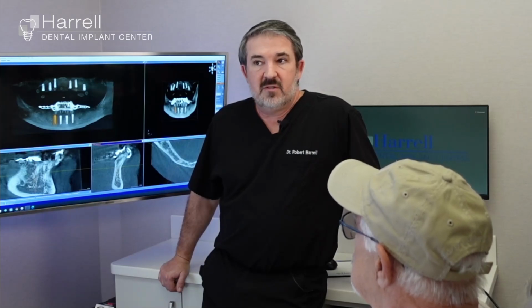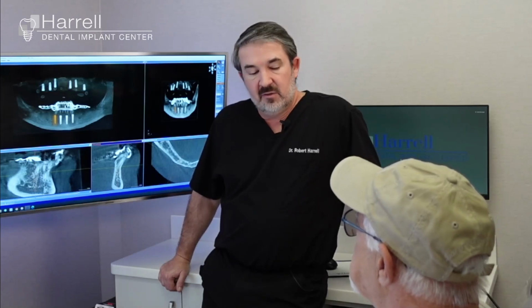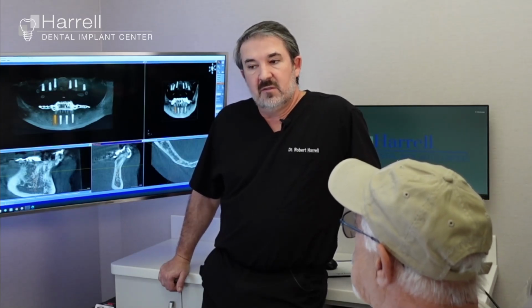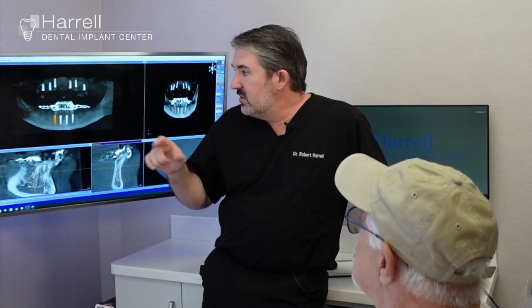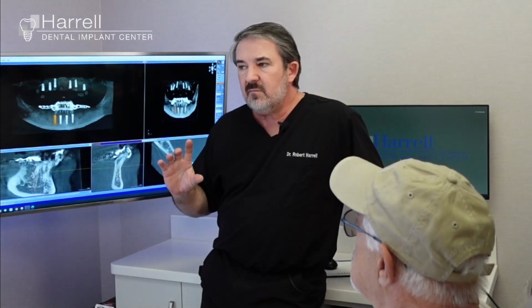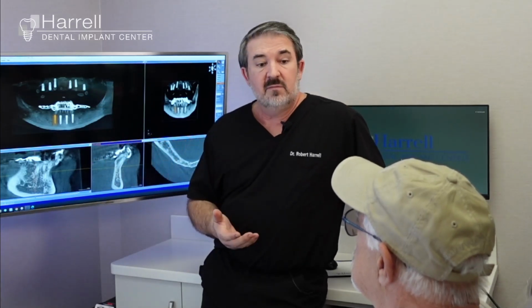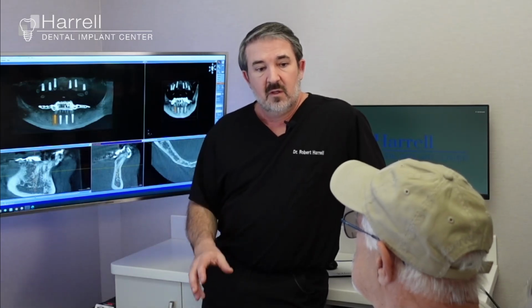Let's see. We've finished that conversion to final. So once we wrap up and get the final set, we've made all the changes you need. Those get installed with little tiny set screws. So there's a series of little screws that screw the teeth onto each implant. Those get torqued in, just like we would use a torque wrench in auto mechanics. We have to set the torque according to the manufacturer's specifications, and then we seal those access holes up and send you on your way.